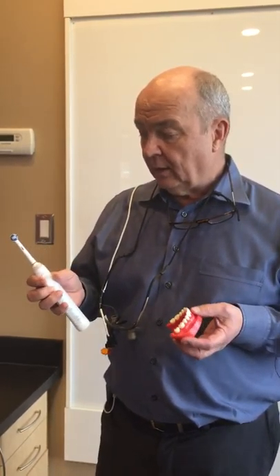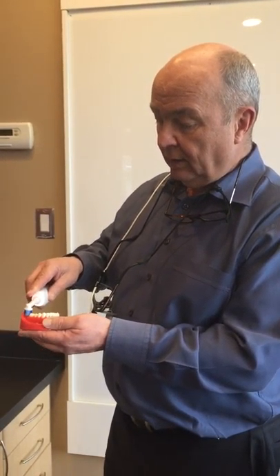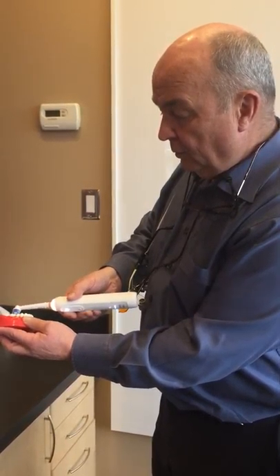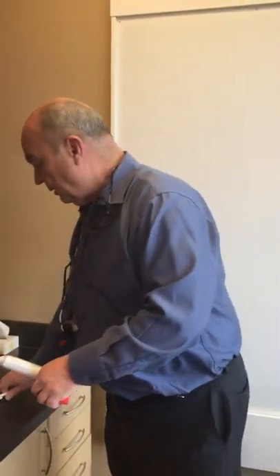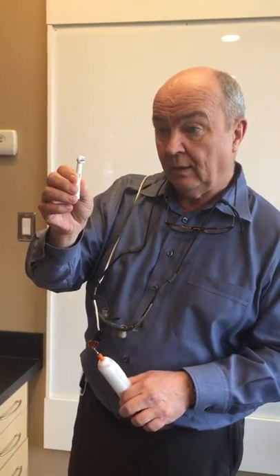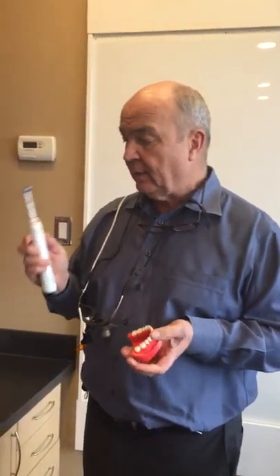It's very clever — you just switch it on and it twists and vibrates. There are several heads that come with it: this one is especially built for braces, and this one is good for getting in between braces.